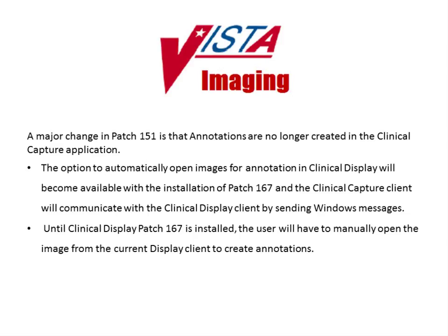A major change in patch 151 is that annotations are no longer created in the Clinical Capture application. The option to automatically open images for annotation in Clinical Display will become available with the installation of patch 167, and the Clinical Capture client will communicate with the Clinical Display client by sending Windows messages. Until Clinical Display patch 167 is installed, the user will have to manually open the image from the current display client to create annotations.